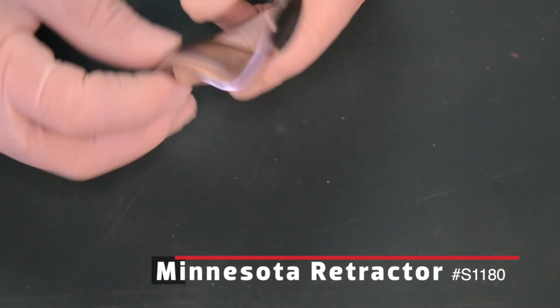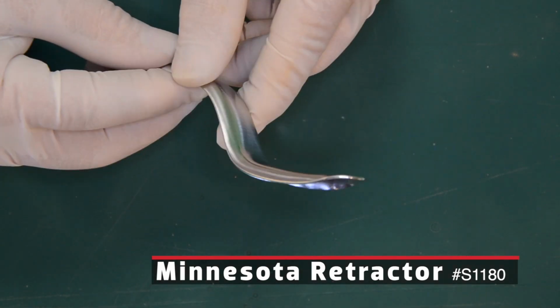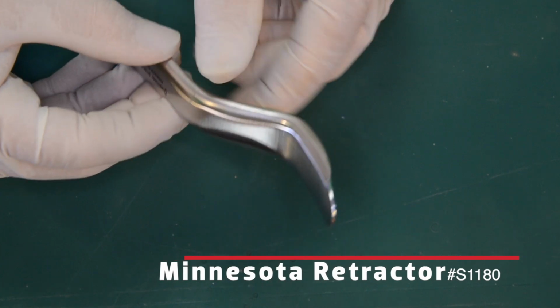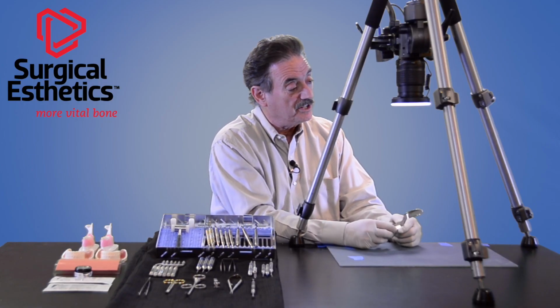Again, as a general instrument, a Minnesota retractor is really important to be able to get that cheek out of the way so you can see what you're doing. Definitely something that we found useful to include in the kit.